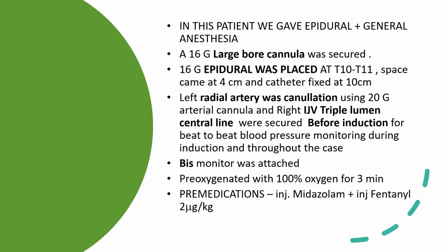in this case. Why? Because we had such a low ejection fraction. We wanted beat-to-beat monitoring throughout the induction and throughout the case. And also, we wanted baseline values of his cardiac output. So that's why they were done preoperatively.